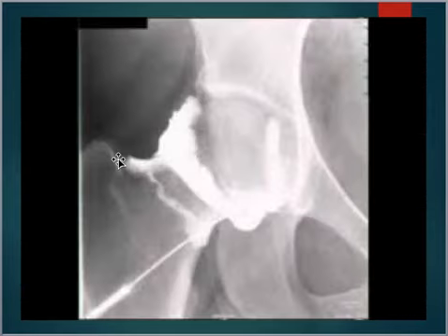This is an image of a hip arthrogram. So you can see here the needle and the tubing coming in. They positioned it right in the joint space, and they put that contrast in to verify that it's in the joint space. And we can always tell that on the hip by, I call it the ring of Saturn. So that contrast is going to form a ring around the head of the femur if it's actually in the joint space.